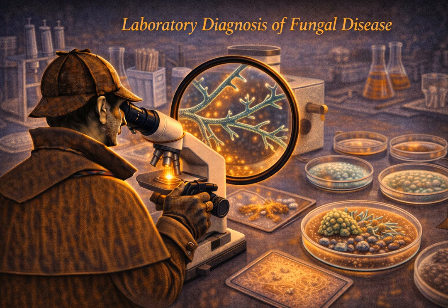So paint the scenario for us. We have that diabetic patient with the sinus infection. We suspect Rhizopus. We take a biopsy of the sinus tissue and send it to the lab. What happens next in the standard default protocol? The standard protocol for processing a piece of tissue in a microbiology lab is to homogenize it. You put the tissue in a sterile tissue grinder, think of a mortar and pestle or a small mechanical blender, to break up the human cells. This releases the bacteria or fungi trapped inside so you can spread them evenly on the agar plates.